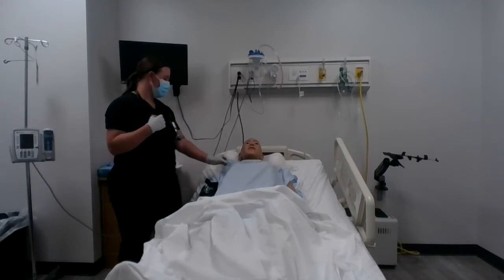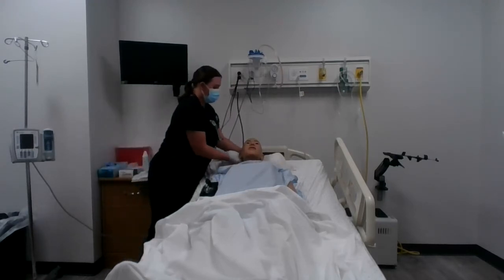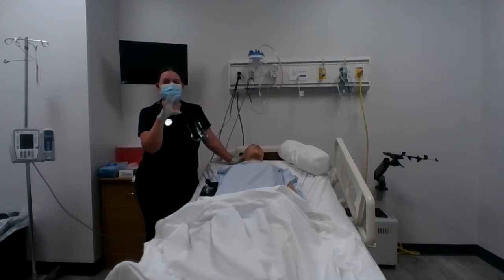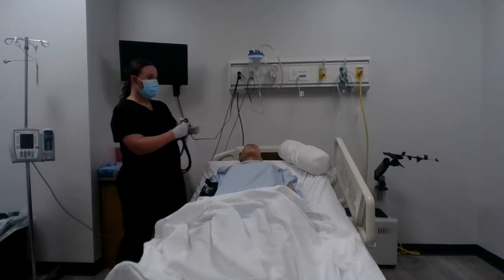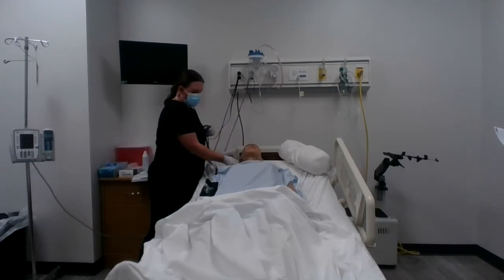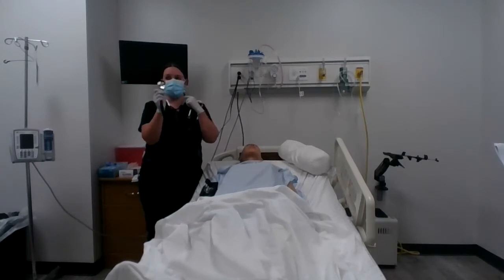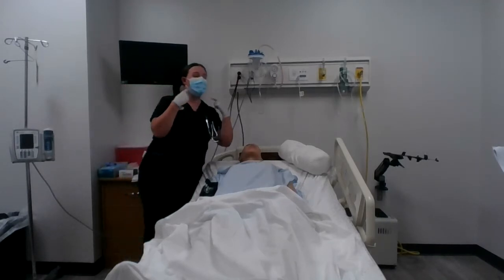Inspect shoulders for any skin breakdown — no skin breakdown noted. Assess for visible protrusion of the jugular veins while the patient is sitting in bed at a 15 to 30 degree angle. Have them turn their head away — we're checking the jugular vein. If it's looking like a garden hose and bounding, that tells us about the fluid status of the patient. When we check the carotid, we should also auscultate using both the diaphragm and the bell of the stethoscope on both sides, listening for any obstructions or narrowing in blood flow.